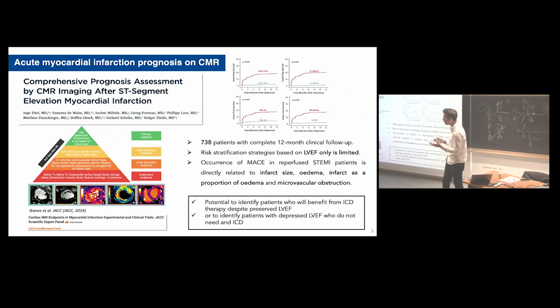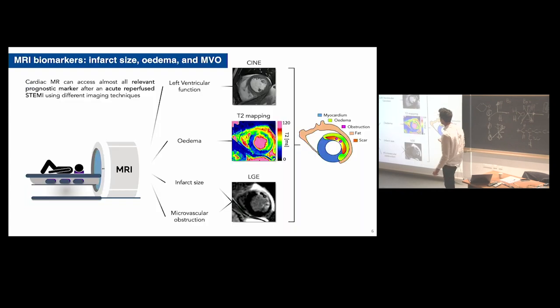So in total, we have 4 important biomarkers that could help us to predict the risk of sudden cardiac death. If you look at the MRI, we can quite easily get these parameters. You might have seen this acquisition, which is one of the best sequences that we have in cardiac MRI. It's called the Cine acquisition, and with this Cine acquisition, we will extract a lot of parameters, and mostly the ejection fraction. We will look at the ejection fraction from Cine.